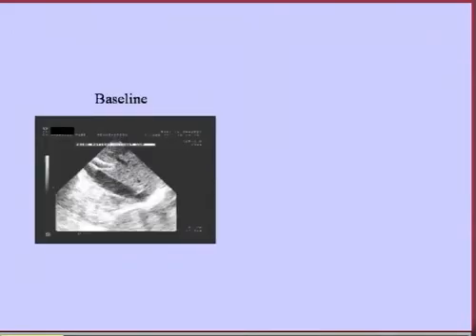Another situation, look at this young woman. She was admitted into the emergency room because of very severe sepsis, and she was severely hypotensive, and she received fluids and fluids and fluids in the emergency department. And as she received fluid, she exhibited more and more pain in the liver. And when she was admitted in our unit, we performed a very quick echocardiography.